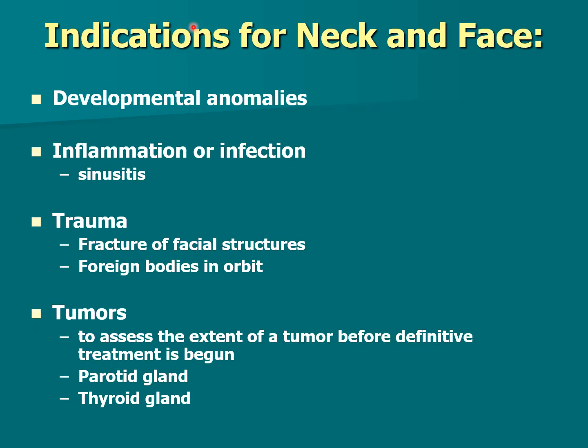So why do we do neck and face scanning? Well, developmental abnormalities. Of course, if you have a face that's disfigured from congenital causes or from injuries, we can do that. And then we can do 3D reconstruction, sometimes for surgical planning or to do cosmetic surgery. We could do these for inflammation or infection, especially the sinuses. We're talking about the neck and the face. The sinuses are often infected, and so we do quite a bit of scanning of the face for sinuses.